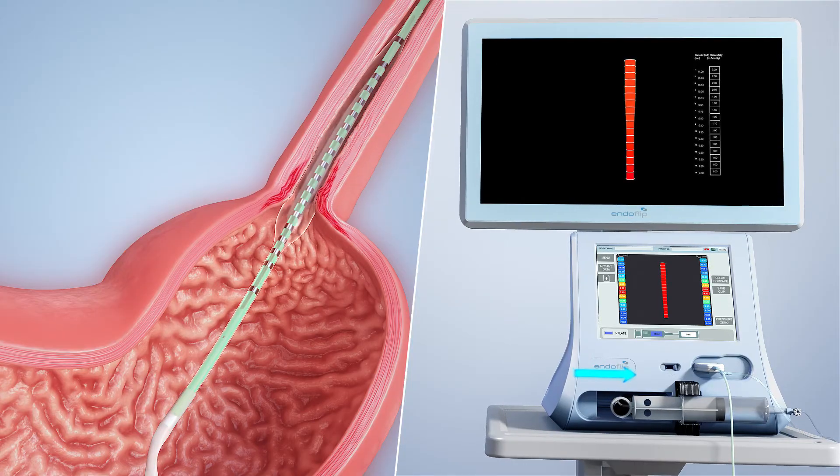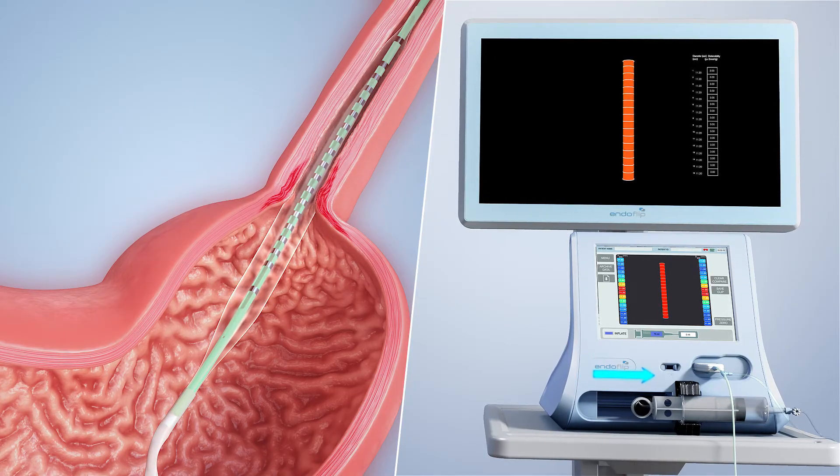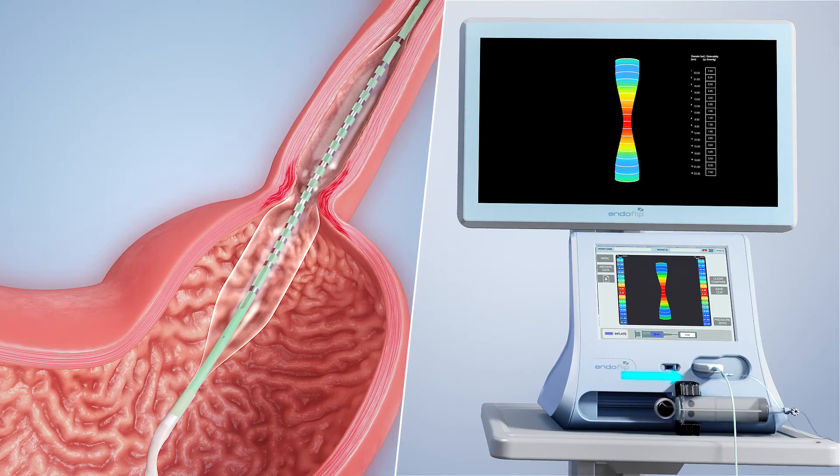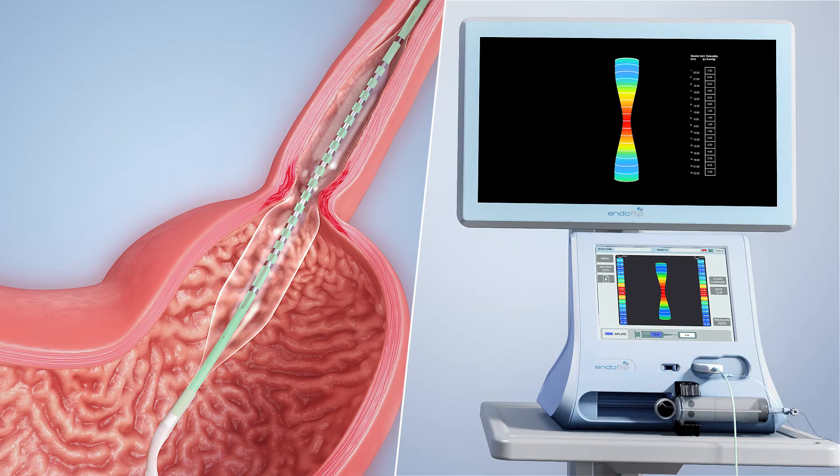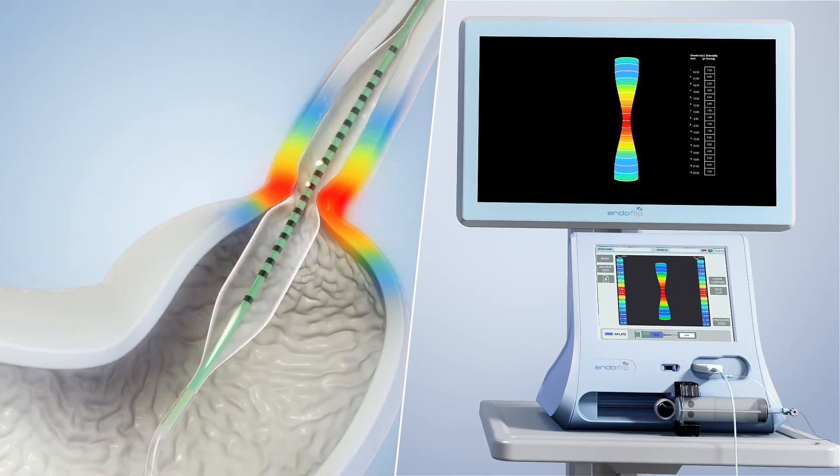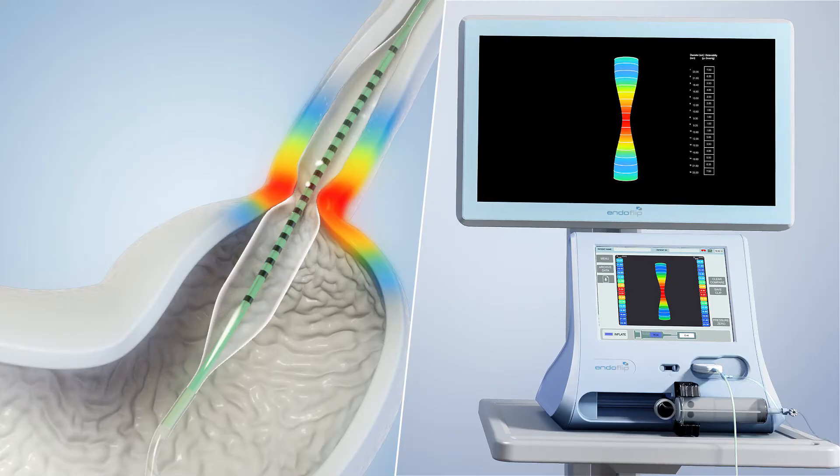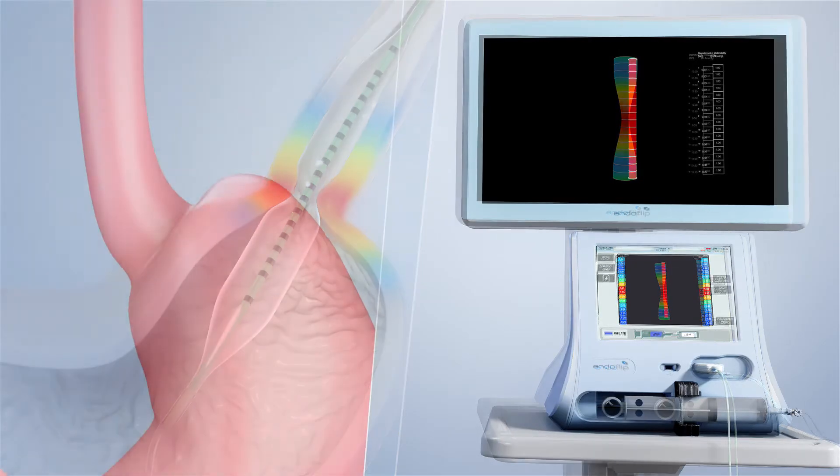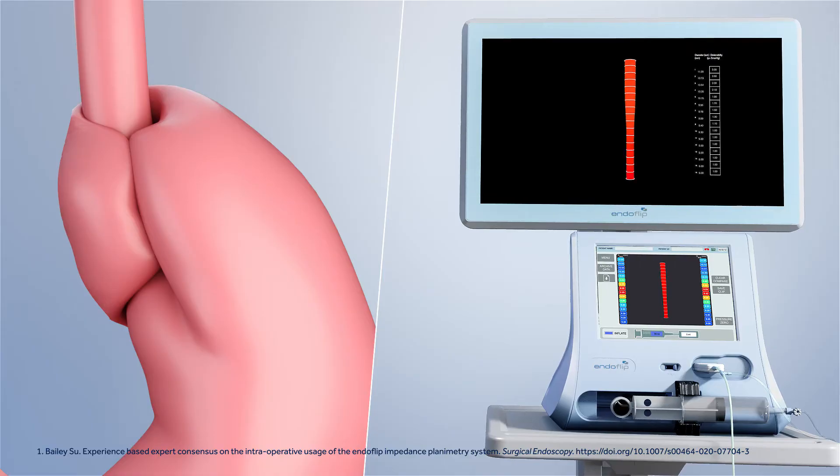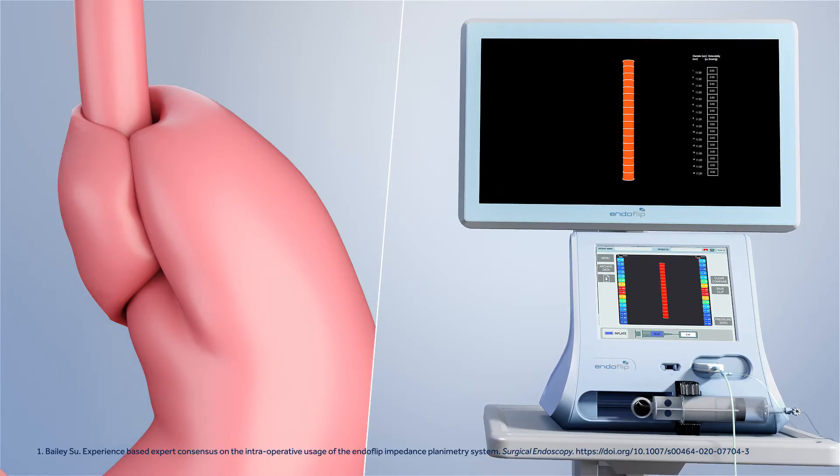As the balloon volume increases, the integrated sensors capture dimensional data of the measured area. The data is then converted into a series of real-time images. This advanced imaging technology can better visualize the tightness of the repair during fundoplication or adequacy of myotomy.